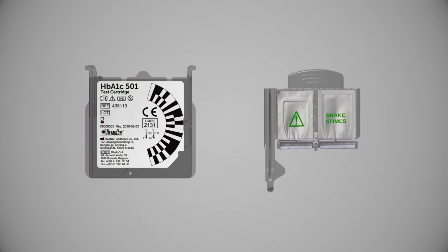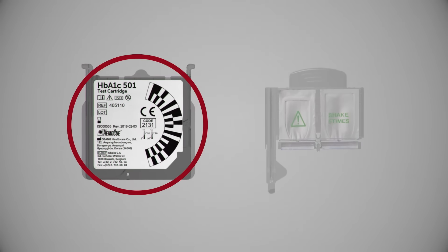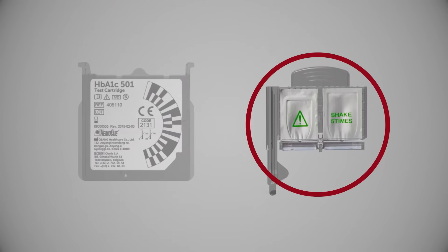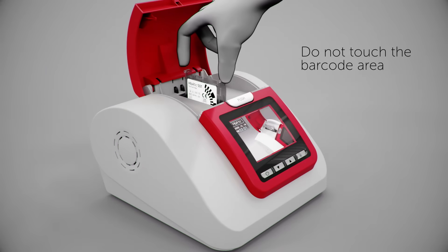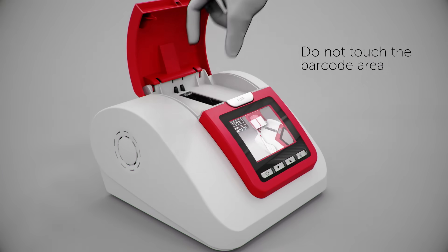The test cartridge consists of a cartridge and a reagent pack. When 'Insert Cartridge' is displayed, insert the cartridge with the barcode facing left. A gentle snap is heard that confirms proper placement.